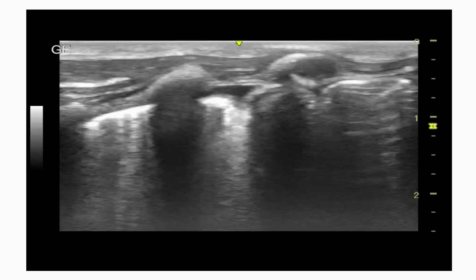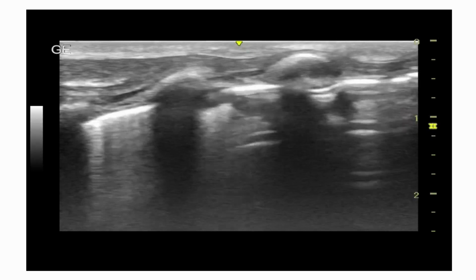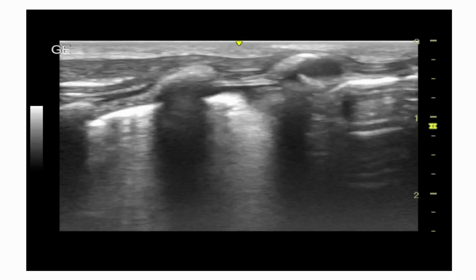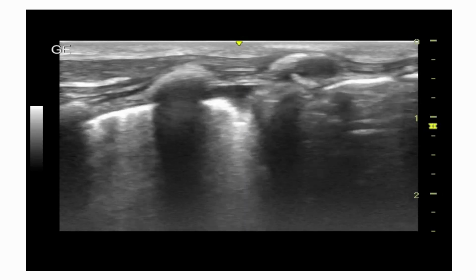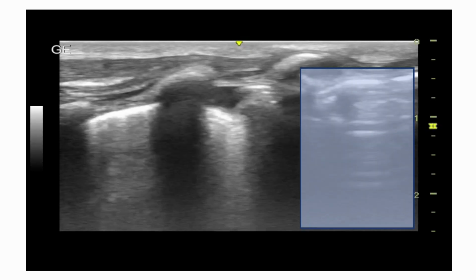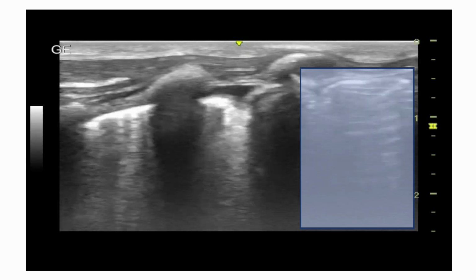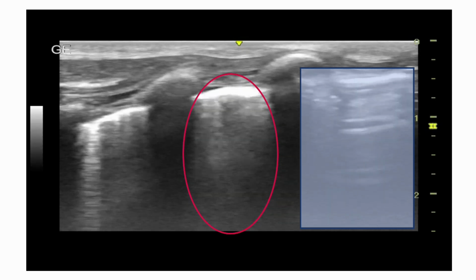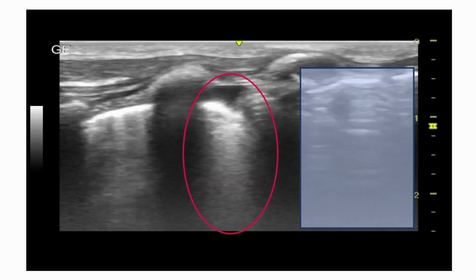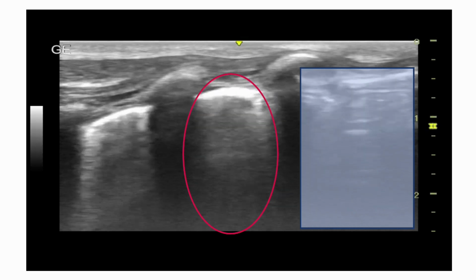In this video clip, you can find the B lines are patchy, in this area here and this area over there, but this area of the lung does not have B lines. That is a normal area, while these areas have pneumonic patches, and the pleura here is thickened and interrupted, also subpleural consolidation indicating pneumonia.